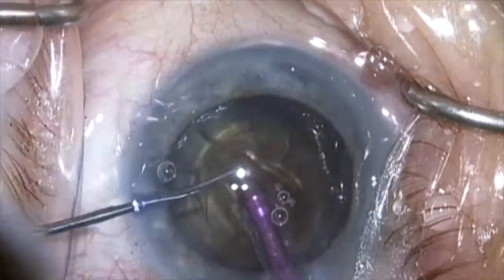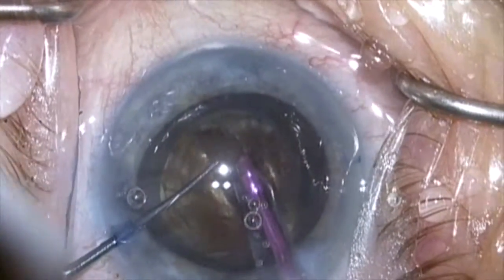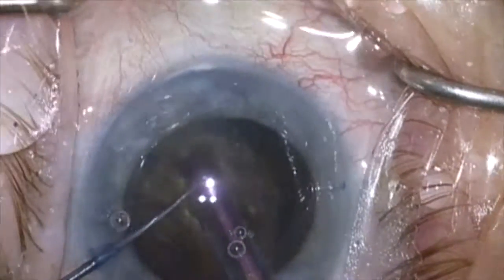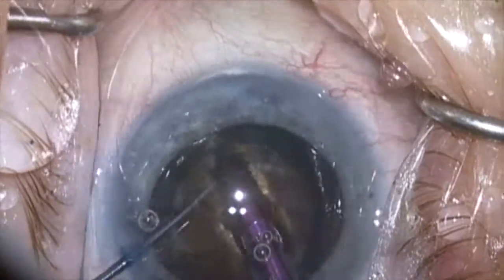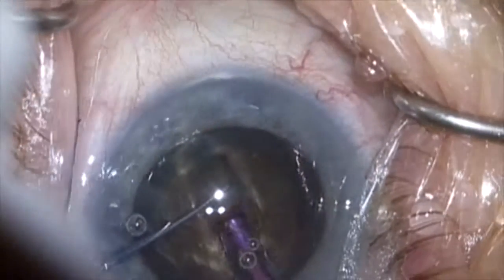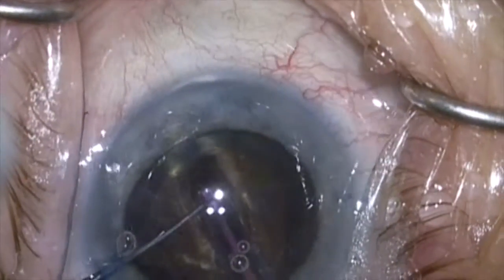I'm always sculpting against the lens — sculpting uphill against the bulk of the lens by constantly rotating, rather than following the downhill path into the posterior capsule. By rotating the lens I can sculpt into a denser part of the lens. Normally I like to chop these cataracts from the get-go, but when I'm doing a really dense cataract like this I like to create a deep wide central groove so I can get down to the posterior plate and then split right through it, so I get less of a jigsaw effect.